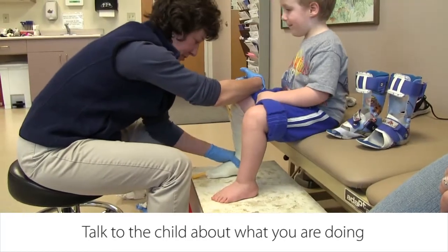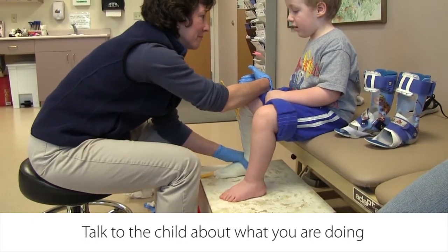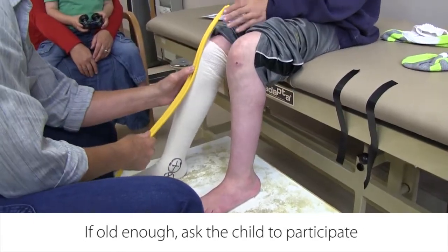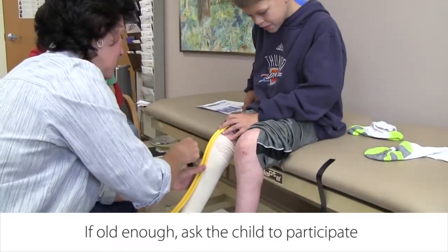Talk to the child about what you're doing. This is a good practice even if the child is non-verbal and you're not sure if they understand you. If the child is old enough, ask them to participate. Holding the buffer strip in place is a good way for them to help.